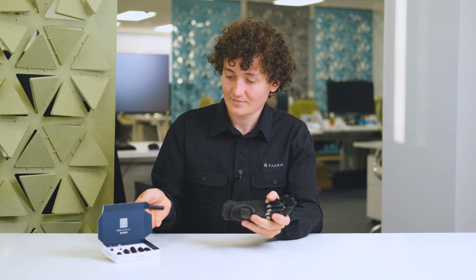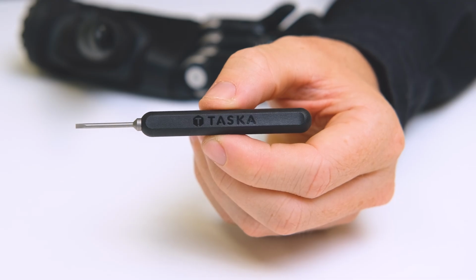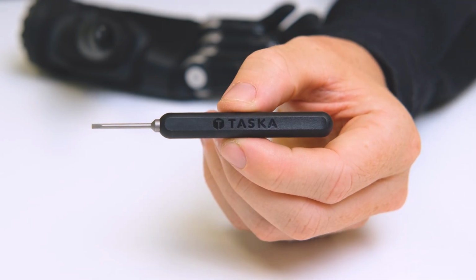Today I'm going to demonstrate how to replace the grip tips on the TASKA CX hand. Each hand comes with a spare set of grip tips and the TASKA screwdriver. Only use the tools supplied to remove and replace grip tips.